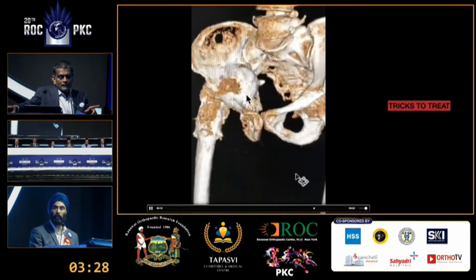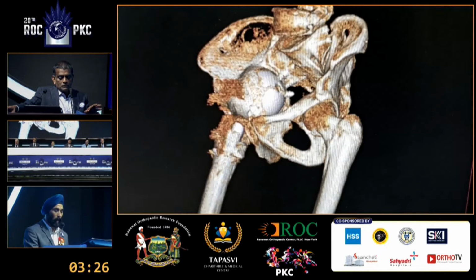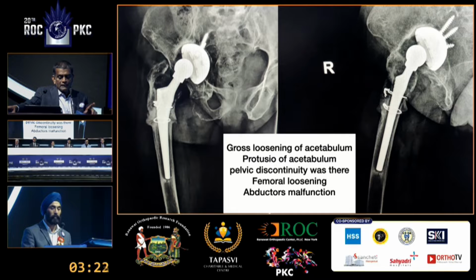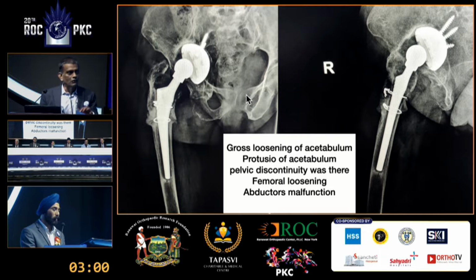Yeah, just go back to the X-rays for a second, please. Okay. Yeah. So that's fine. You see this thin rim of bone that's forming, that's remodeled bone. Absolutely. When you find that bone, there's no pelvic discontinuity. That's a usual rule of thumb that you're not dealing with an instability here. Otherwise, bone remodeling cannot occur on the background of instability. Absolutely. So that's a clue that probably not that. It's not a 100% rule, but it is a pointer. Okay, go forward, please.